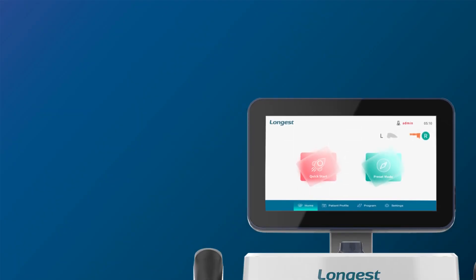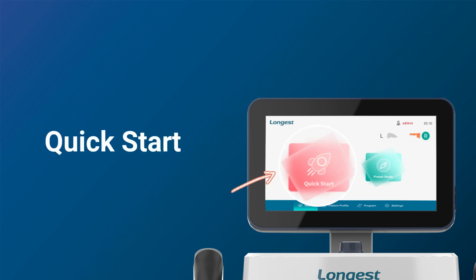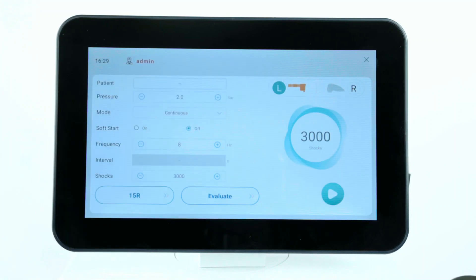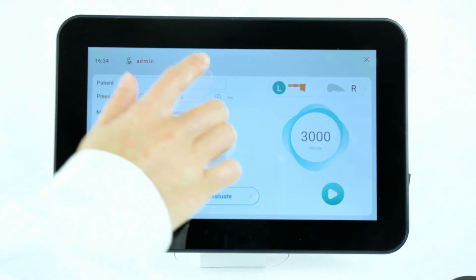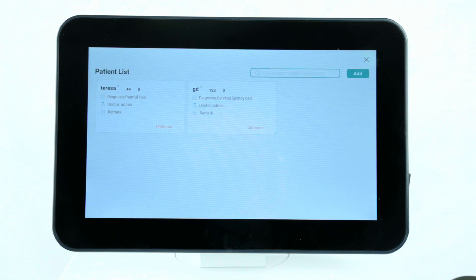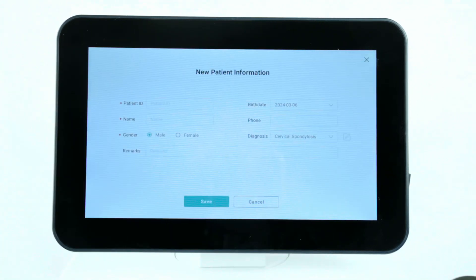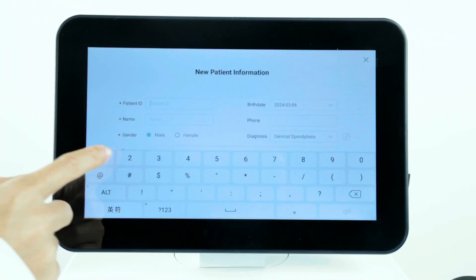The device offers two treatment modes. Let's walk through the setup process of quick start mode first. Click the quick start button to enter the parameter setting interface. Click the box of patient, you can bind the previous patient information or add new patient information.